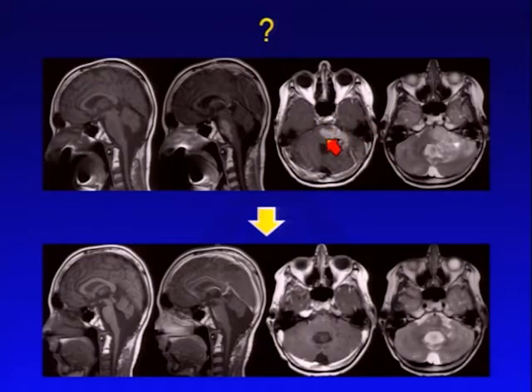We see suddenly a significant contrast enhancement in the left middle cerebellar peduncle. It is irregular, centrally it's hypointense, a lot of edema around it. It looks ugly, and it has some mass effect, but not that much mass effect. So if you are in this situation, at this time point, it can be difficult to say for sure this is pseudo-tumor progression due to treatment.